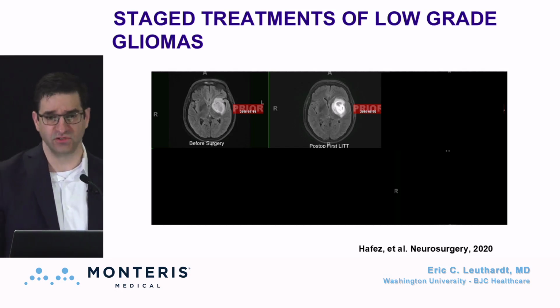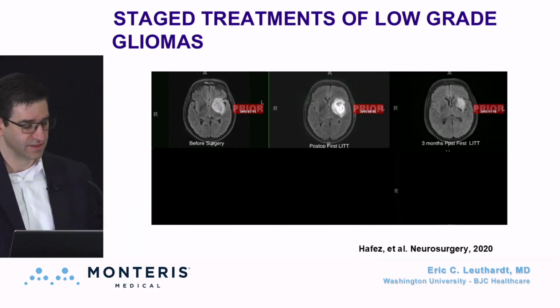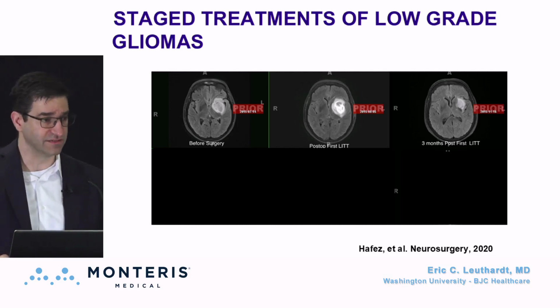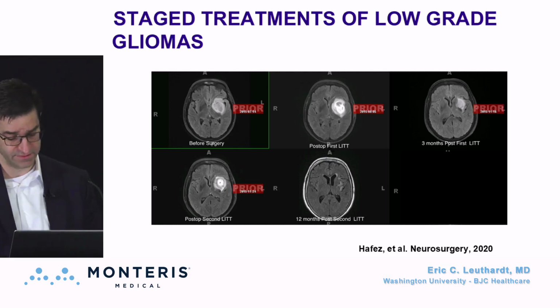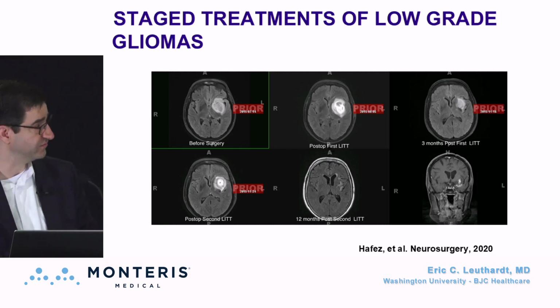But if it's a low-grade appearing tumor, you have some time on your hands to utilize laser in what I'd call a staged approach. If you try to treat that all at once with laser, you'd have some real swelling and mass effect problems. But if you take it in parts, you laser a certain amount of that volume up front, maybe to the maximum of 3 centimeters in maximum diameter. You wait a few months, it's substantially shrunk down. You laser the remainder of the tumor, and then possibly they require radiation and chemotherapy after that. And then this is what you get 12 months later. So you've turned what is a larger craniotomy with some meaningful morbidity into 2 low-risk procedures. And I think this is absolutely fantastic.